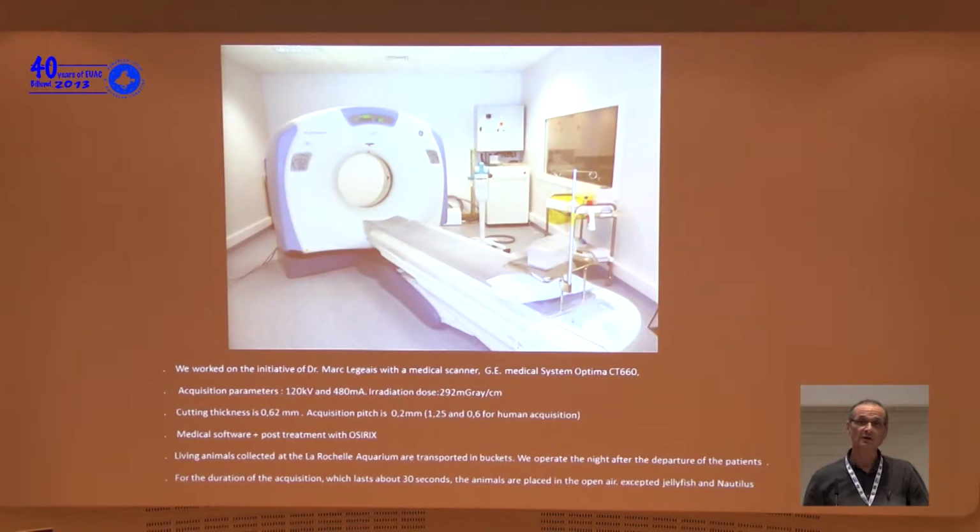For these experiments, we used living animals collected at the La Rochelle Aquarium, and we transported them in buckets. We operate at night after the departure of patients, and we took care to handle animals without contaminating the scanner room or the examination table.